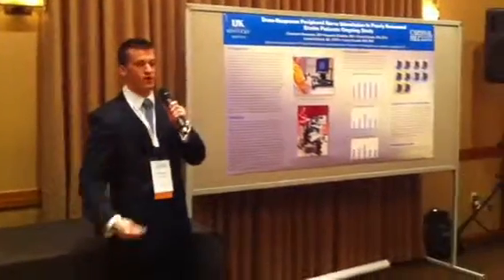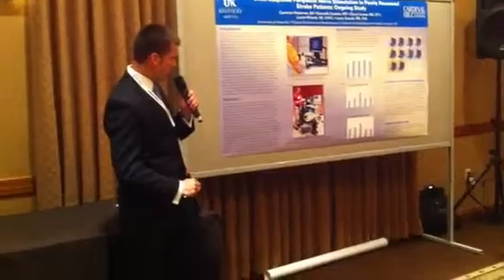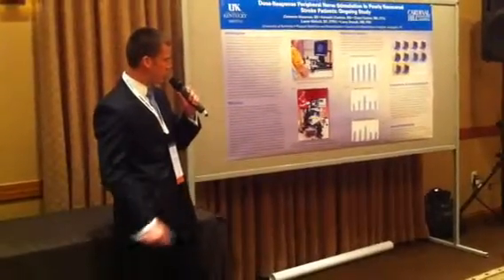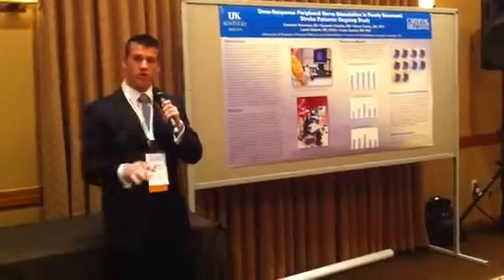Patient was receiving the correct amount of stimulation throughout the study. Moving down here, we see an evaluator and a subject undergoing transcranial magnetic stimulation. And what the evaluator here is holding is a coil. The patient is wearing on her head a tracker device that is also on the coil.